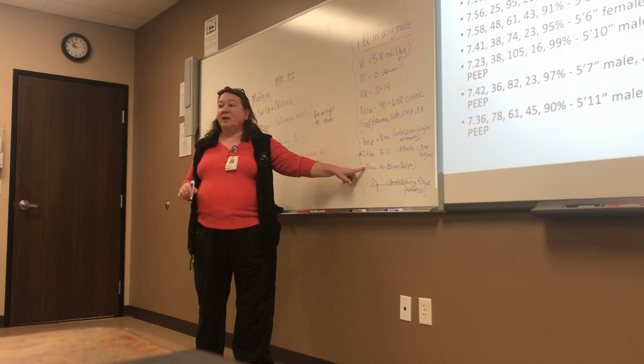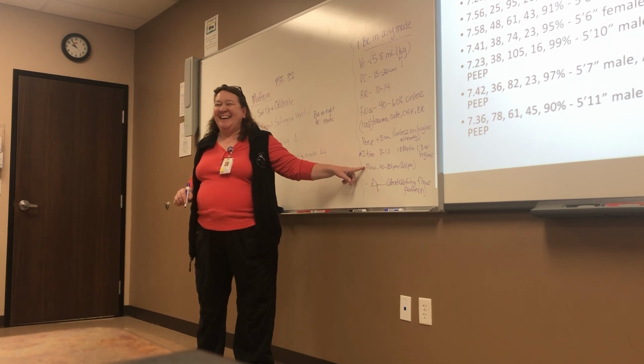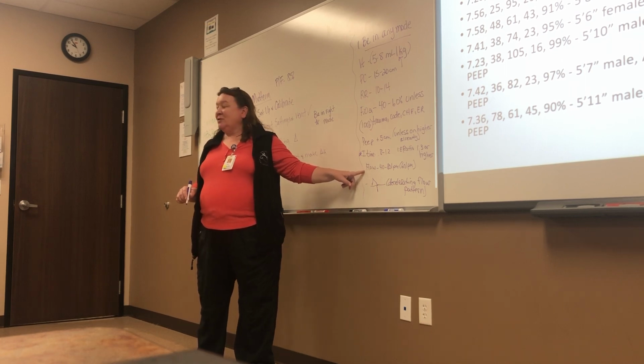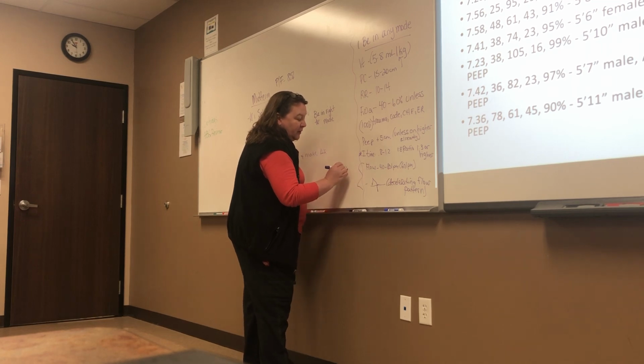Can you change the flow in pressure control? No, you can't. So you also cannot change the flow. These would be volume control only.